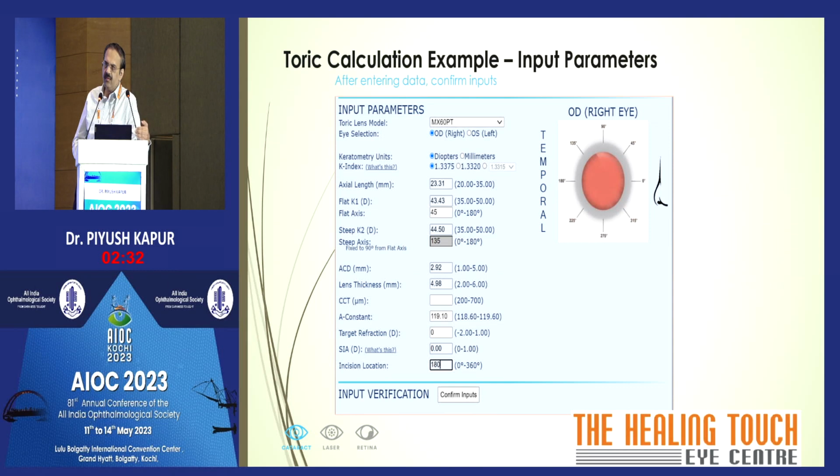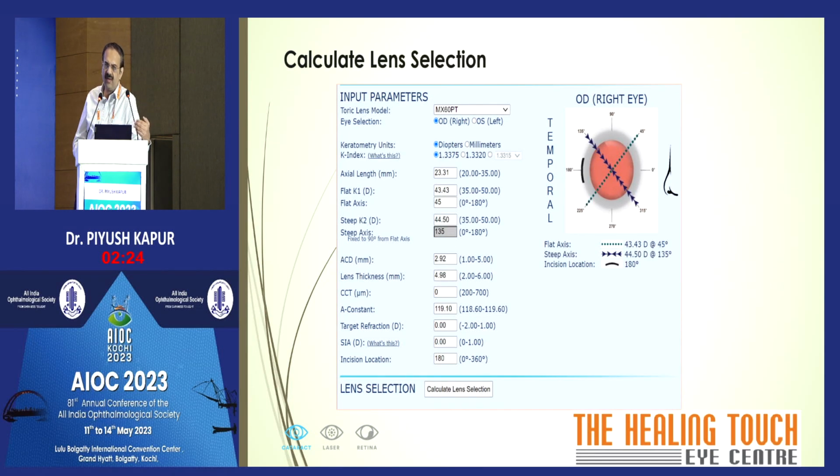If I have to err towards one side, I generally always go with the calculated sheet which is given to me by the company guys, because I have seen that they have optimized according to their lens, and they are a little more accurate when we consider the alignment of the lens.